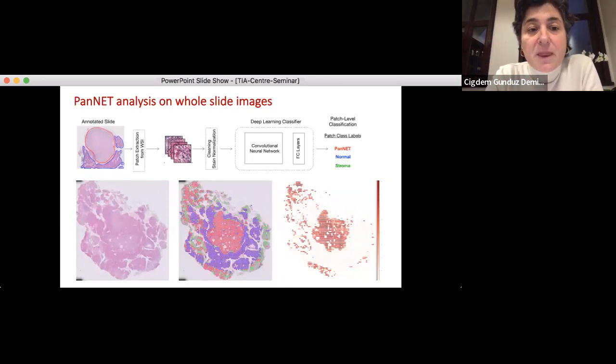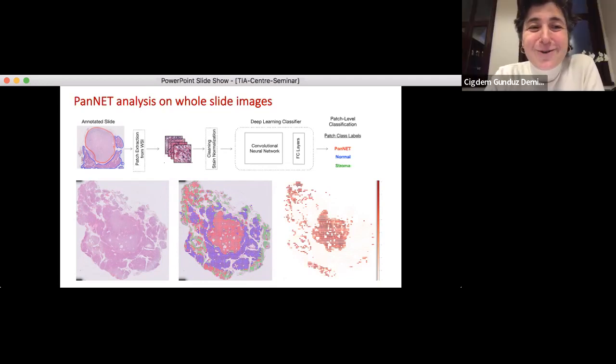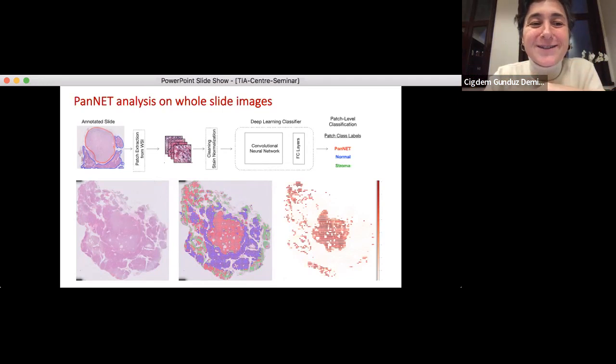I guess as well, this means that you wouldn't have to spend as long annotating precise segmentation boundaries, would you? For that one, of course, that is the first step after finding these regions. So now we are in the process of getting more annotated data.